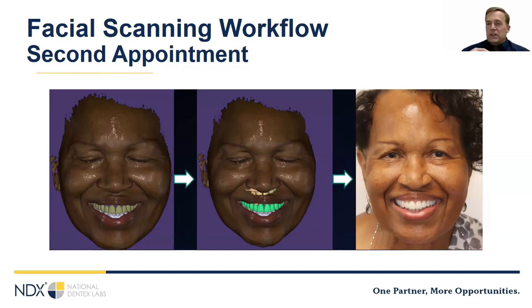I've seen a bunch of these cases delivered, and the intraoral photos, it's kind of funny because you'll look at the scan ahead of time, and then the doctor screws in the all-on-4 prosthetic, and you're like, holy smokes, it's just the same.